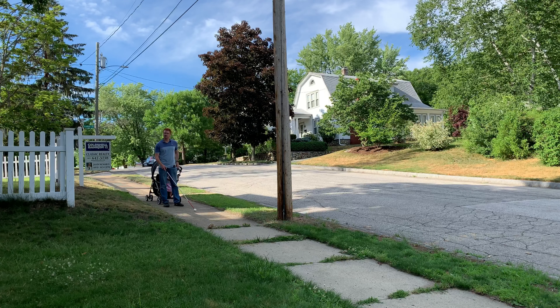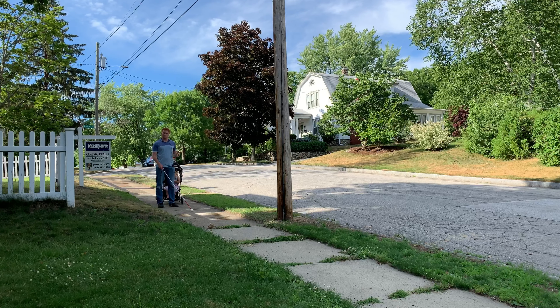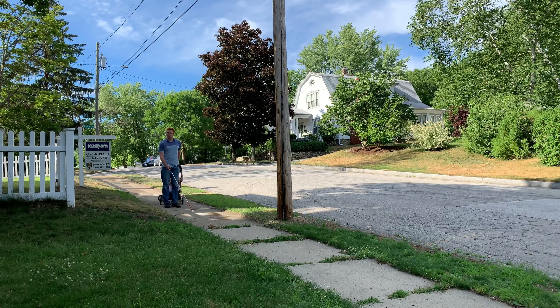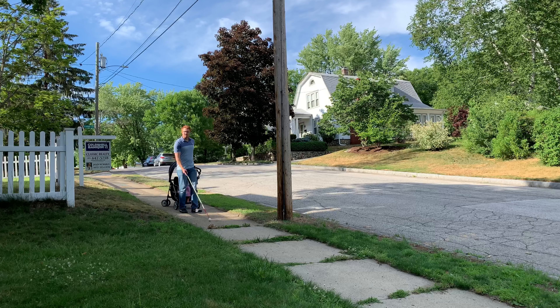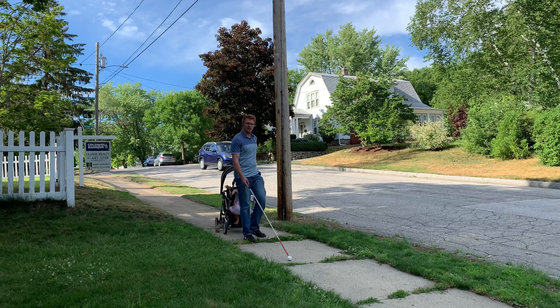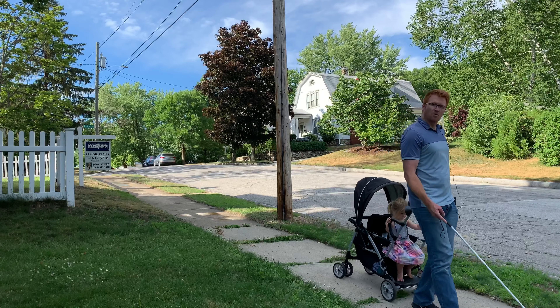Now for my third and final alternative. Again, on this residential sidewalk, I have a standard stroller here behind me with my toddler sitting in it. This alternative is probably my least favorite of the three, but it is to pull the stroller instead of push it. Some strollers are better designed to be pulled than probably this one, but this is just an example of another way of traveling with a toddler or child when using your cane. Because when you're pulling the stroller, you still get the cane out in front of you for obstacle detection. It's pretty tough to control both the cane and the stroller at the same time, which is partly the reason it's not one of my favorites, but it might be worth trying for you.